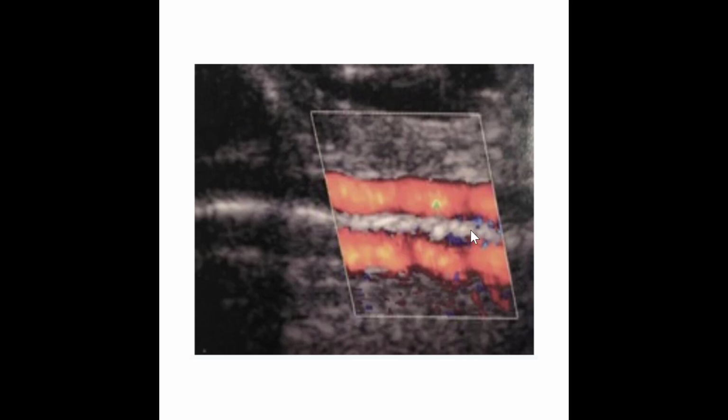The back posterior wall of the blood vessel is acting as our mirroring reflector. So the sound comes in, interacts with this. The way that the sound bounces through there, it flips it and creates a mirror image deep to the real vessel. This is of the subclavian artery. So this happens to actually also be lung right underneath it here. So around the lungs, sometimes around some of the bowel gas, is where we typically see these mirror artifacts.